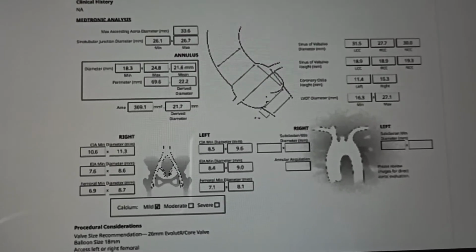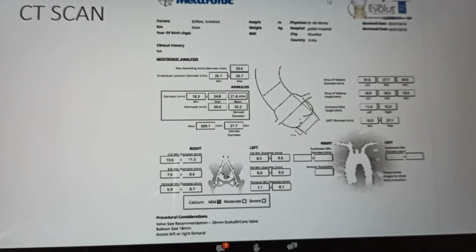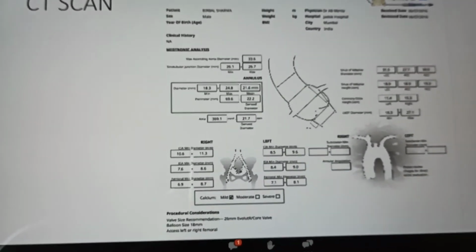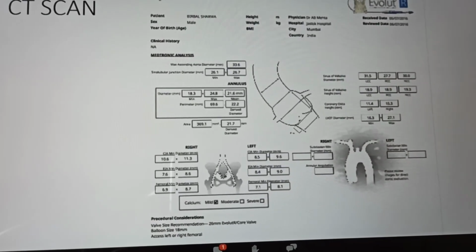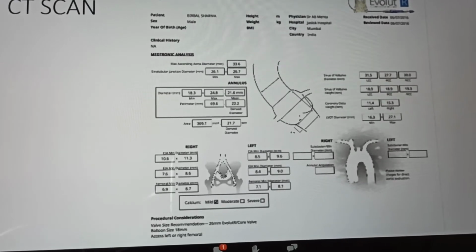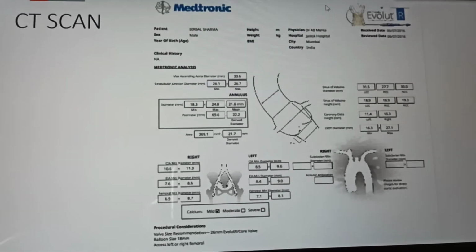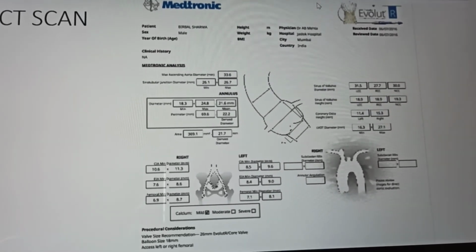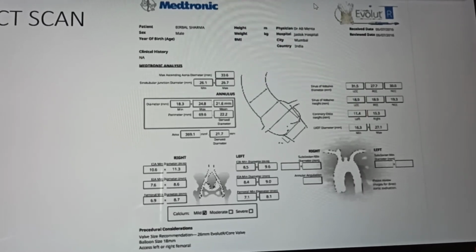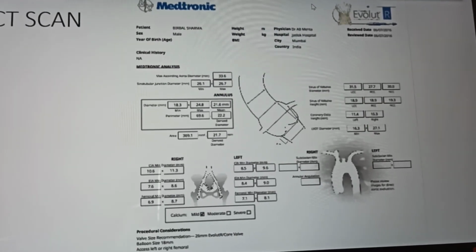Thirdly, we also want to know whether there is enough calcification, because we need some amount of calcium. You know, the average lifespan of Indians is now 68. Therefore, we are going to get more cases of atherosclerotic aortic stenosis, and we will have to deal with this problem more and more frequently, so we should be prepared with all the kinds of possible complications and avoid them. Okay, so this is about the CT.